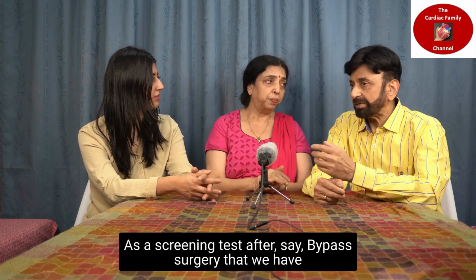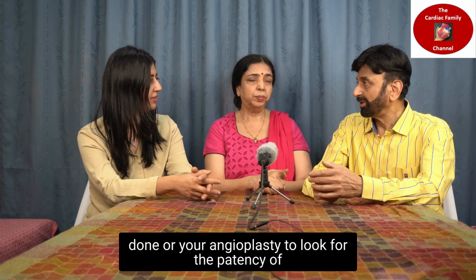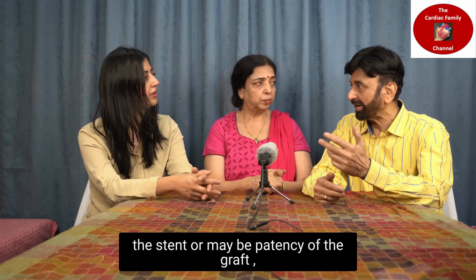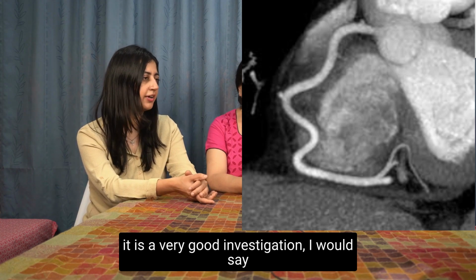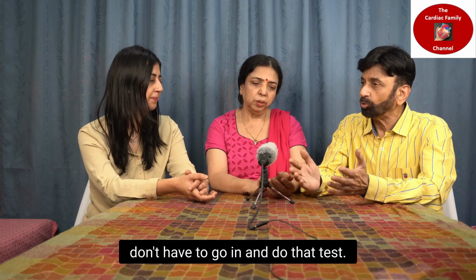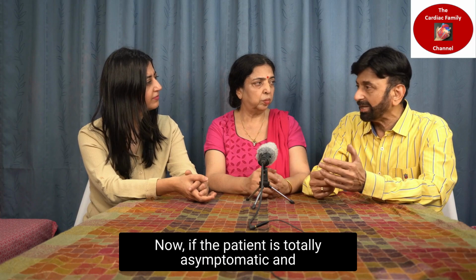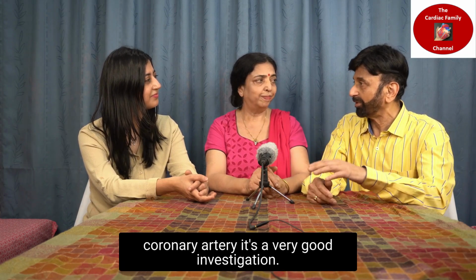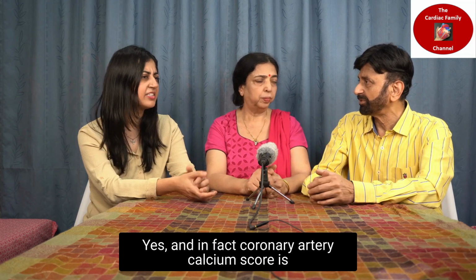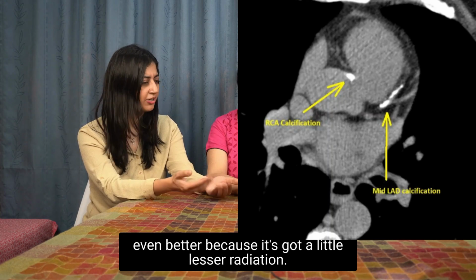As a screening test after, say, bypass surgery that we have done, or your angioplasty, to look for the patency of the stent or mainly the patency of the graft, it is a very good investigation, I must say. For graft patency, we don't have to go in and do that test. Now if the patient is totally asymptomatic and very keen to rule out coronary artery disease, that's a very good investigation. In fact, coronary artery calcium score is even better because it's got a little lesser radiation.